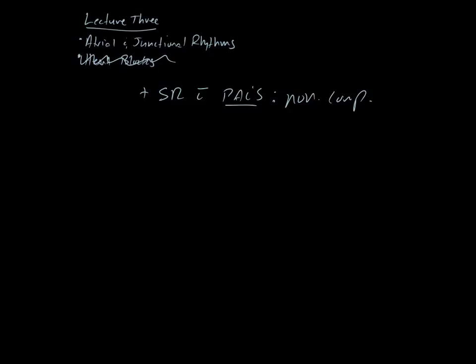Generally, the P waves are going to be in the same direction as the P waves for the underlying sinus rhythm. You guys okay with that? We talked about sinus rhythm with PJCs, premature junctional complexes. Again, these have a non-compensatory pause, but what can differentiate them from PACs?